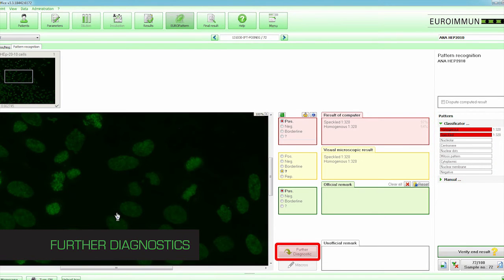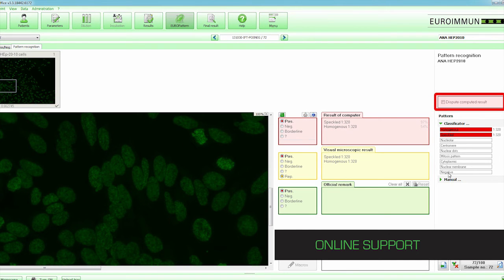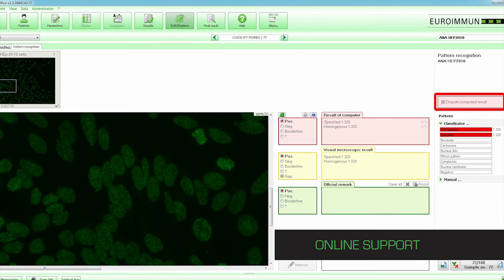The Further Diagnostics button allows the sample to be retested without changing the original examination. If the laboratory technologist should need assistance with a difficult sample, the images and a query can be forwarded to Euroimmune experts for analysis and further support.